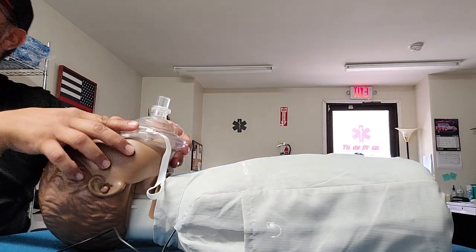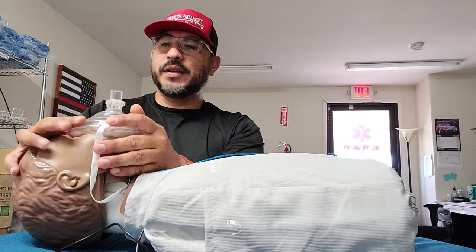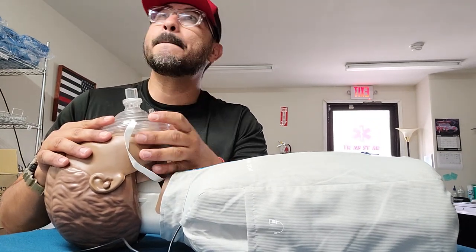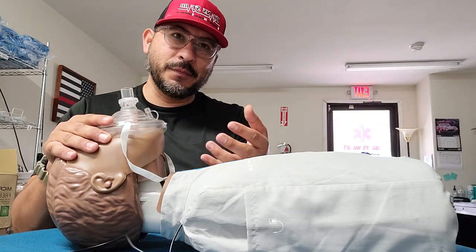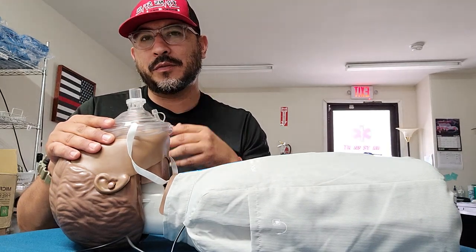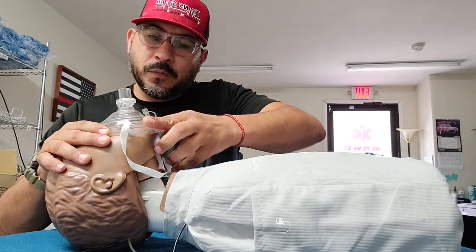You want to place the thumb of your other hand along the lower edge of the mask — I would rather hold it this way. You're going to be holding it with your thumb, pressing that seal against the bony part of the chin or jaw. So you want to open the airway by using the head tilt chin lift. That way you want to make sure there's no obstruction — the obstruction can be coming from the tongue itself falling into the back of the airway, causing the patient not to be able to get air into the trachea and into the lungs. We're doing this with the simple head tilt chin lift maneuver while maintaining the seal.